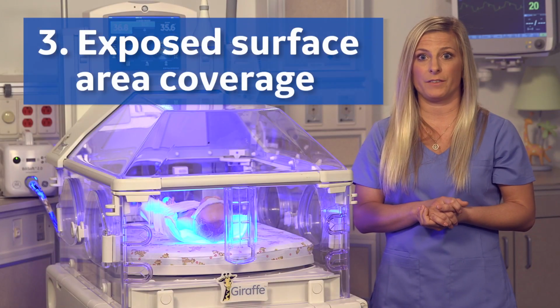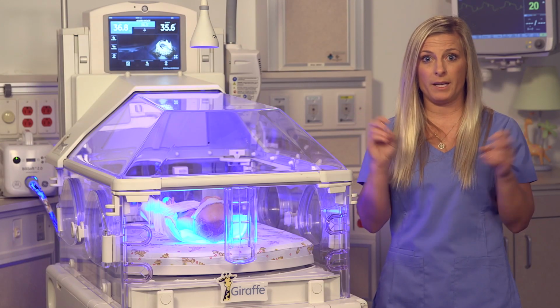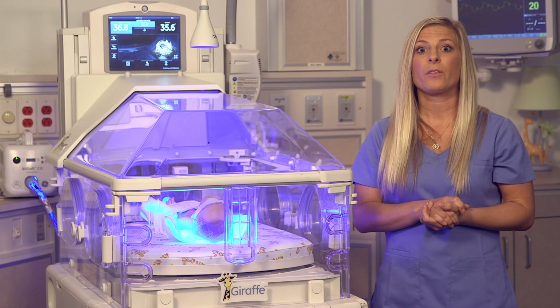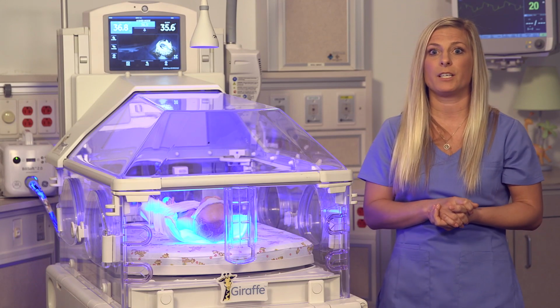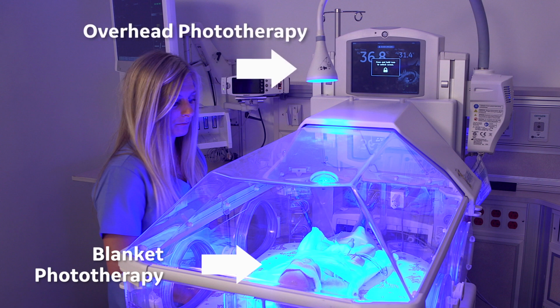The more body surface area exposed to light, the better. So you might hear of double phototherapy, and this is where it can apply. The right way to do double phototherapy is putting an intensive light underneath the baby and an additional intensive light overhead to cover the complete body surface area of the baby from head to toe.